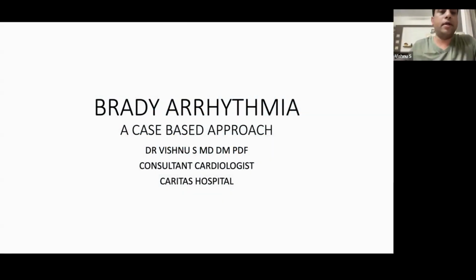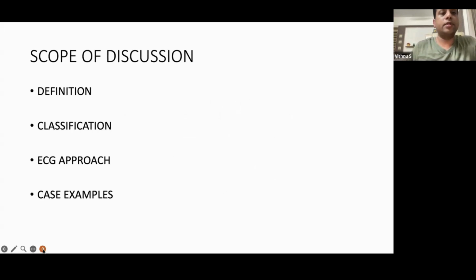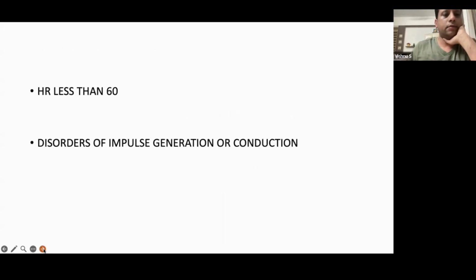Evening. I will be discussing bradyarrhythmias today, a case-based approach. In the scope of discussion, I will cover the theory very little and will go to the interactive section with ECG very fast. Bradycardia is defined as a heart rate always less than 60.